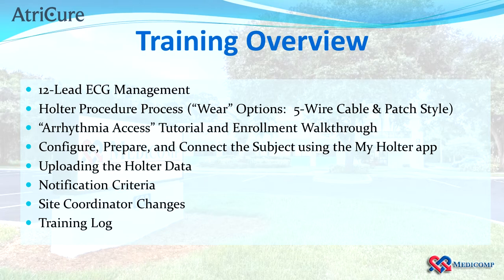Here is an outline of what we will review in this presentation. We'll start with discussing the management of the 12-lead ECG data and advise you of your role in providing the data to us. Next, we will provide an overview of the Holter monitor, kit contents, and site supplies. Then we will discuss the flow of events that you will need to follow for each Holter procedure and introduce Medicomp's Arrhythmia Access website. Please note that you will need to re-enroll the subject each time they are to wear the Holter monitor, which means that you won't be able to use the previous enrollment.